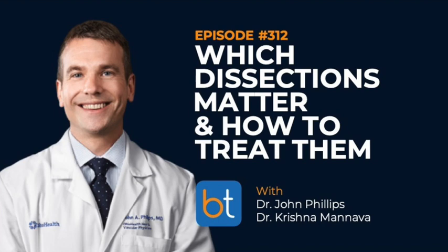Got it. And so when you see a dissection and let's say it is flow limiting, what's your algorithm? Where do you start after that? Well, I want to get a makeup of what the plaque looks like. If it's heavily calcified and I've dissected it, and I feel like it's flow limiting, I'm going to need to put a scaffold in.